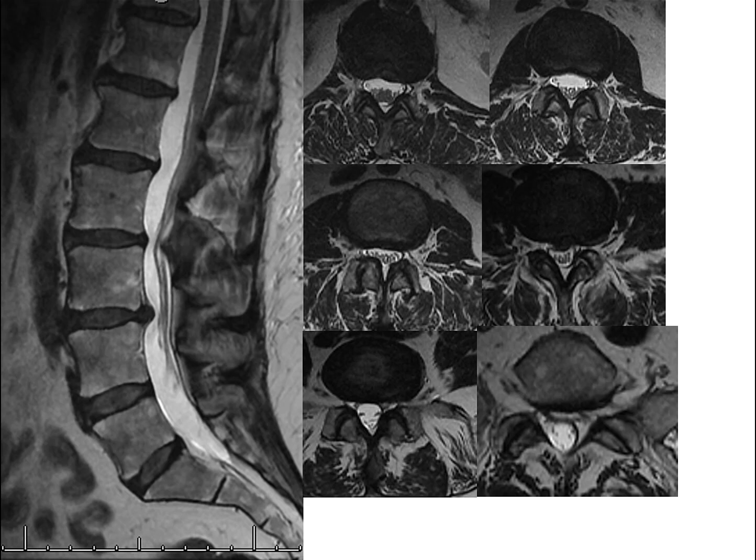I'm not at all interested in sticking a micropore, triangular dowel across the SI joint and saying it's going to fuse. I think that's hocus pocus. I had a hard time filling these things with bone graft and getting post-op CAT scans on every one of them, looking at the destruction I'd done in the joint, putting bone graft across it and 2 lag screws across it, and a bunch of them didn't fuse. They don't fuse for a reason, and to think that we can percutaneously fire these things in and get 85 to 95% fusion, I don't buy it. So I'm not wowed by any of the technology that you've shown me.